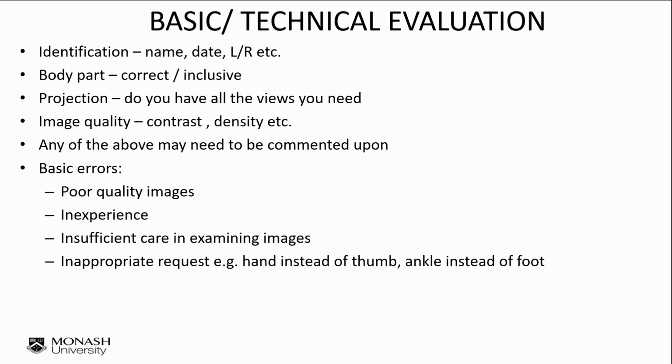And it is where you see a pathology and your eyes are actually transfixed on that pathology, and you forget to scrutinize the rest of the image, and there might be a more significant pathology that has been missed.